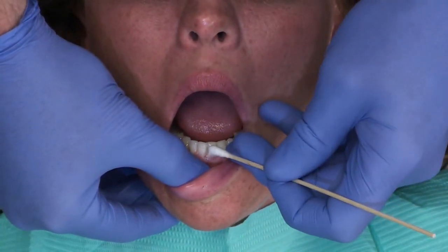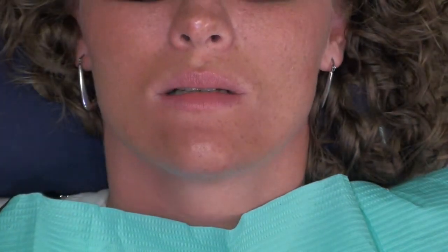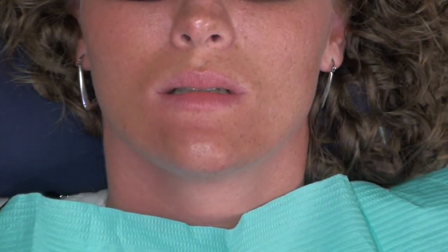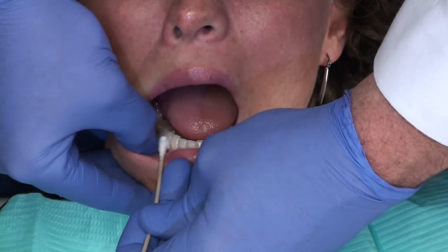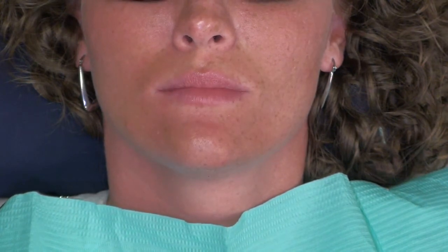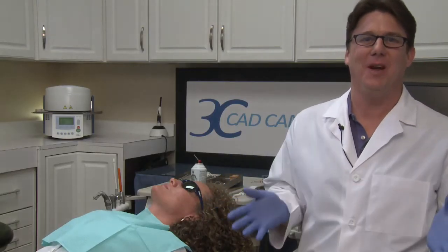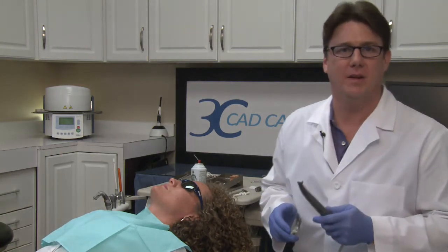Let's go back to our patient for just a moment and test the tooth with endo-ice. I'm going to spray a little endo-ice on a cotton-tipped applicator and test to see if our patient is numb yet. First let's test an anterior tooth — raise your hand whenever you feel something. She just raised her hand, which gives us a sense for how sensitive her teeth are. Then we go back to the premolar — and she's feeling nothing. So I've got my pre-op scan and full anesthesia for my patient using the Onset Approach. Now I'm ready to pick up my handpiece and go to work on my preparation.